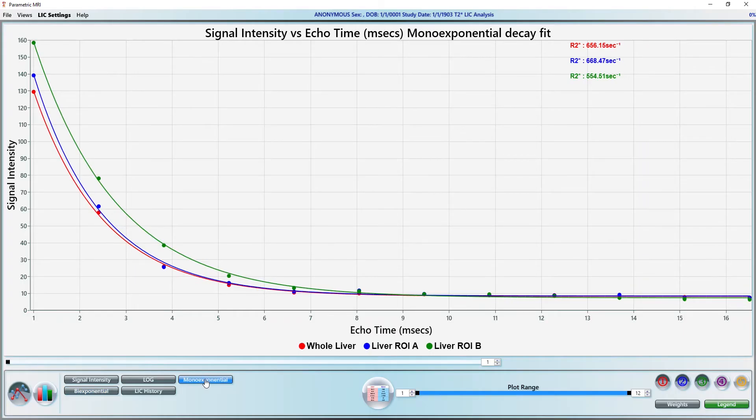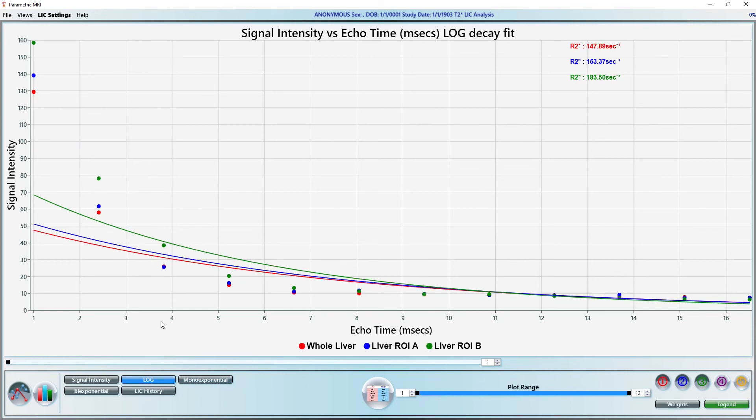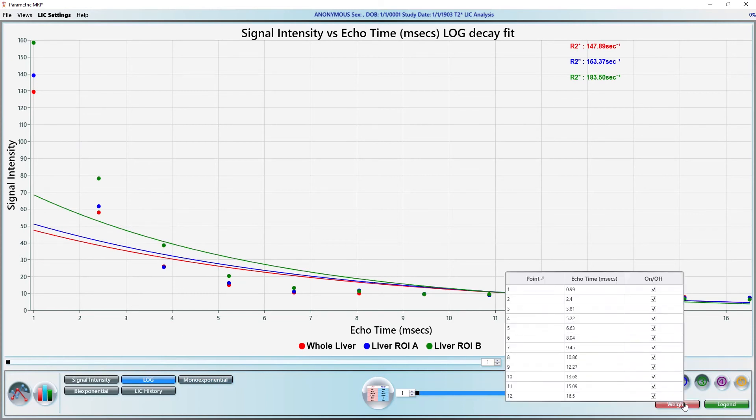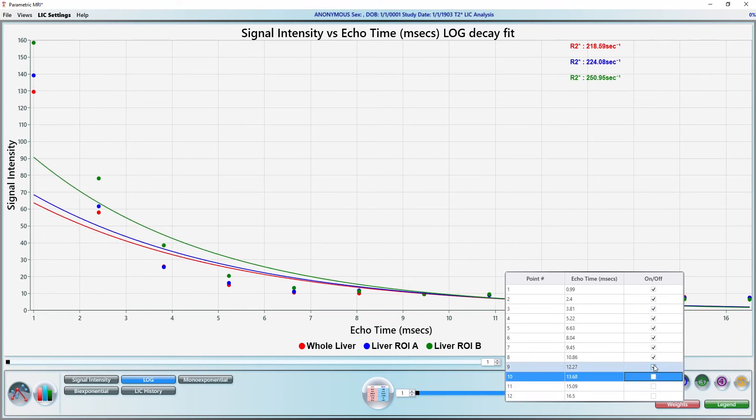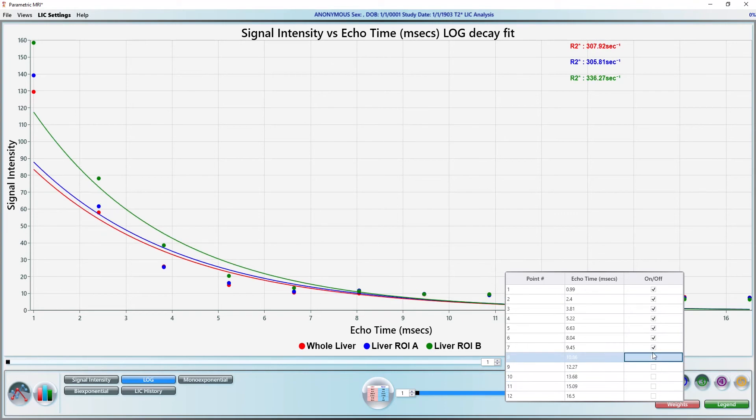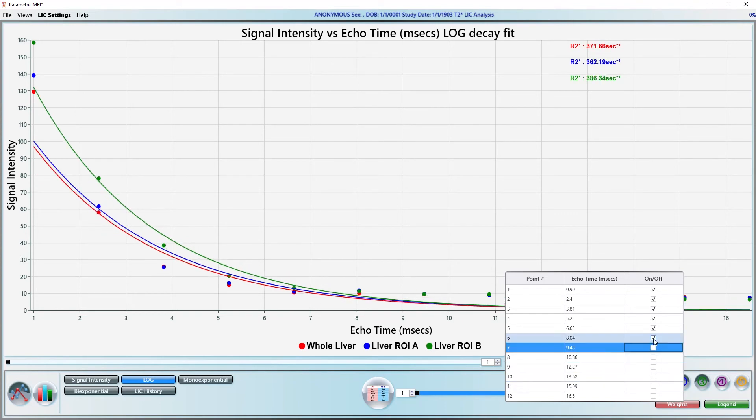Another common model for R2 star liver iron data is the truncation model. We can use the truncation model by first switching to the linear mono-exponential model. Next, we turn on Weighted Fitting and bring up the weight toggles by right clicking on the weights button. Here, we can toggle various data points on and off. This selection can be subjective.